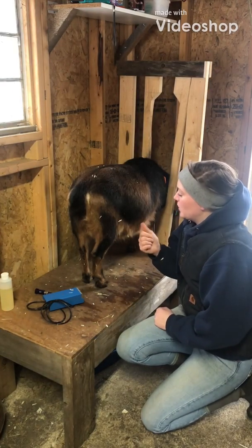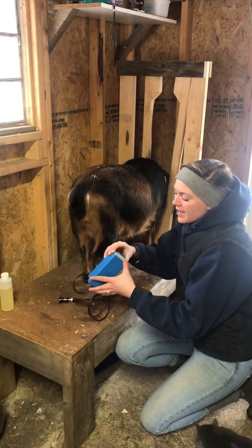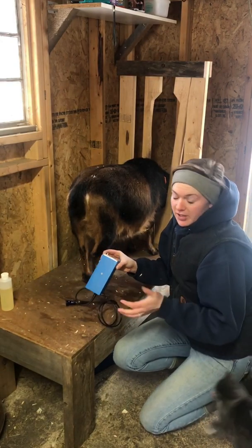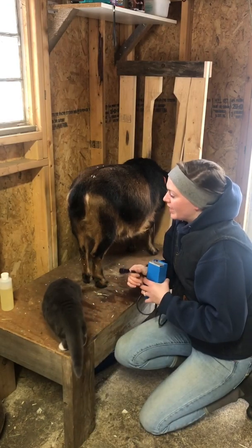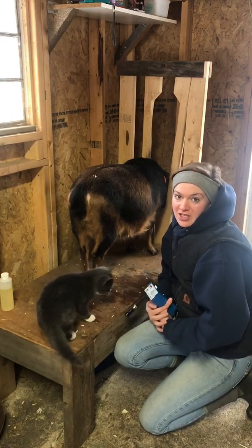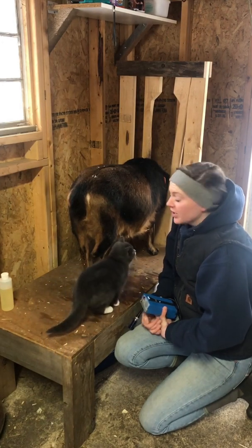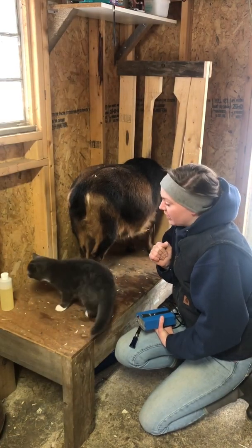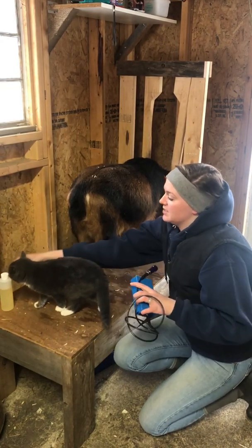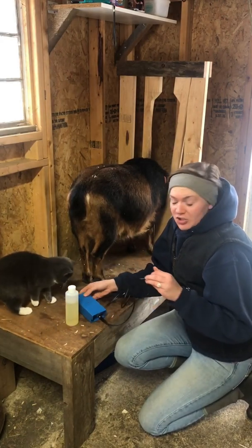Hey guys, today we're gonna do a pregnancy test on Audrey here with my PregTone. Full disclosure, I do already know that she's pregnant — I just forgot to do the video when I initially did a preg check on her with this. So I figured better late than never. As always, I have my useless assistant Cheryl here to get in my way and do nothing but drink my vegetable oil.